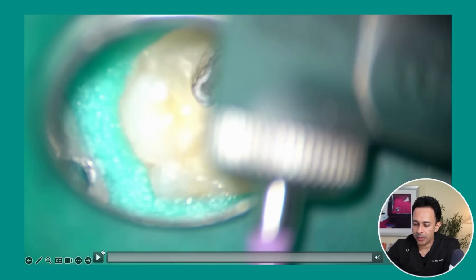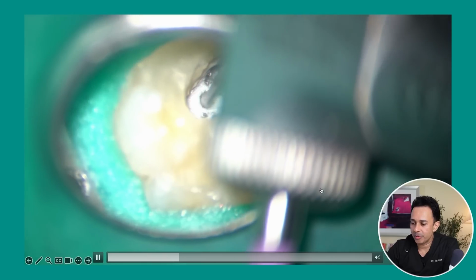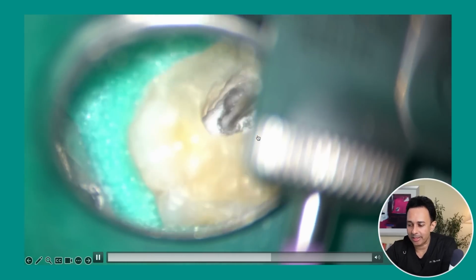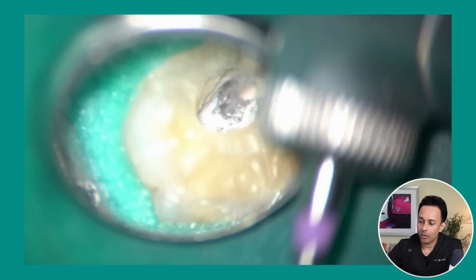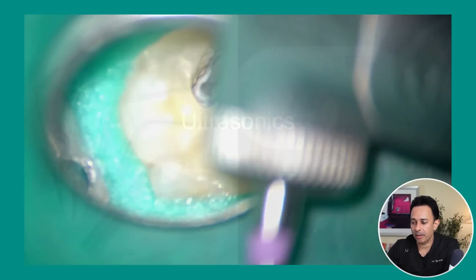Here's a video showing the Muntz burr in action. So you can see here, that's me using a Muntz burr, and you can always visualize what the tip of the burr is doing when you're working deeper in the canal, in the pulpal floor, or even in the canals for that matter. Okay, so Muntz burrs, a very good tool to have in your armamentarium.